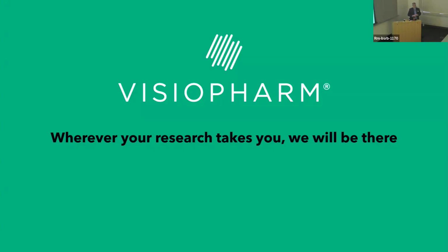Great questions. Let me see if I can rephrase them so I can remember them. The first question was, how do we avoid selection bias with AI? And the answer is AI, especially if it's trained by annotations by us, is going to be as biased as we are in the training and the data set that we give it.